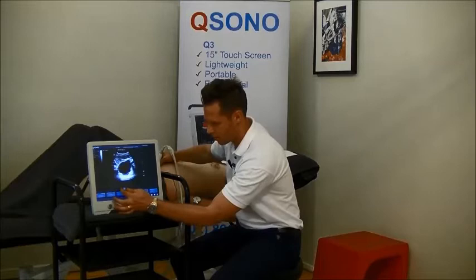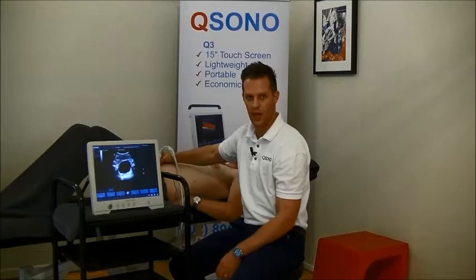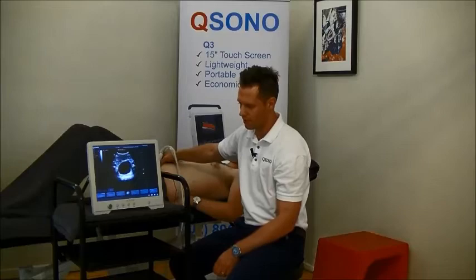Okay. So now we have an image of the bladder here. A couple of important things to consider. If you put too much pressure on the probe, it's going to distort the picture and it's going to make the bladder look like it's moving. So we're just going to keep the pressure nice and even throughout the exam.